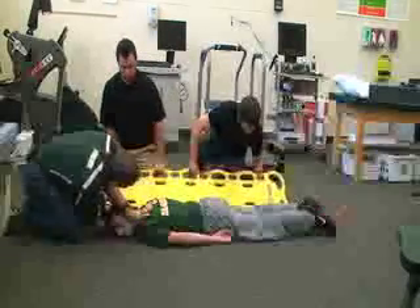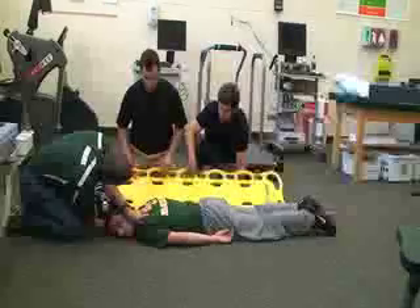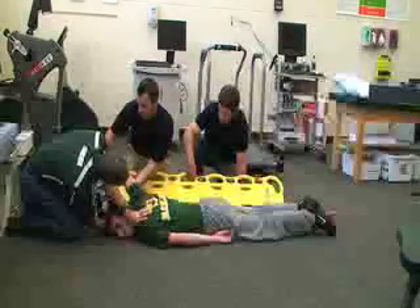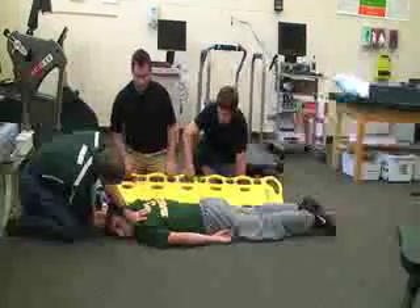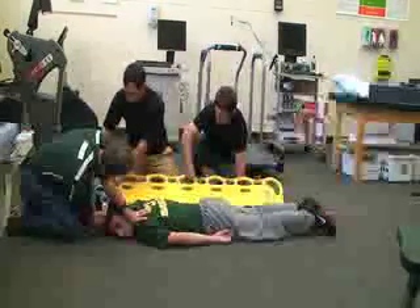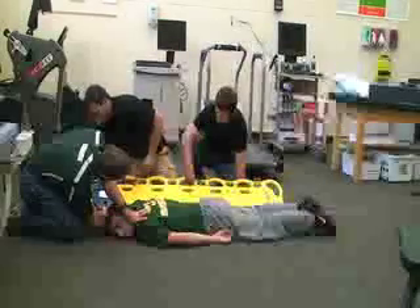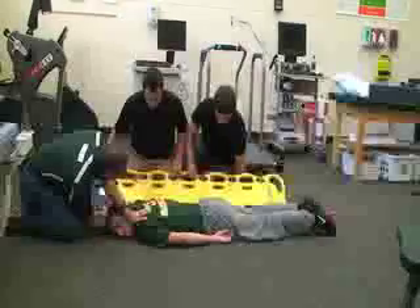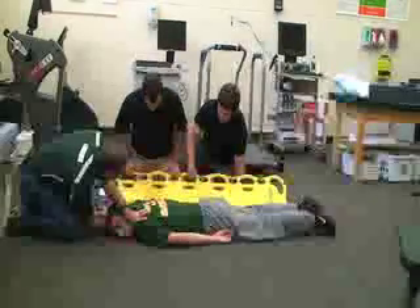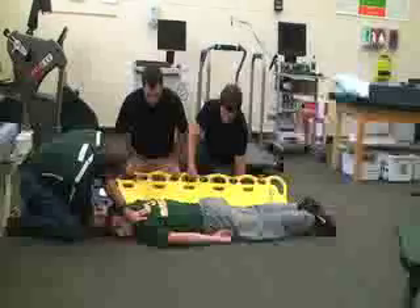I'm going to ask one of the rescuers to raise the victim while I'm maintaining immobilization. Rescuer two will lift his arm up on the back side of his head. Both rescuers have the head pieces off of the headboard and they also have a cervical collar that we'll put on once we turn them. The straps have been unbuckled so those are disconnected, and they're placing the side edge of the backboard right on the side of the body.